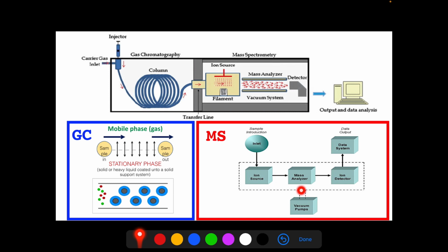After the ions are separated, they are detected and the signal is transferred to a data system for analysis. Also notice that all spectrometers have a vacuum system to maintain a low pressure. This high vacuum is required for operation, and it minimizes the ion molecule reactions, the scattering, and neutralization of ions.